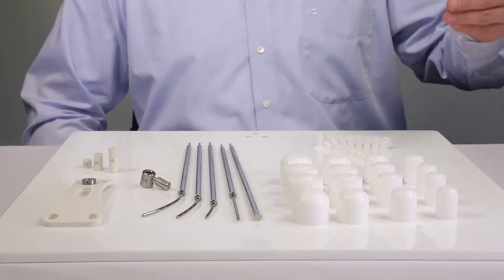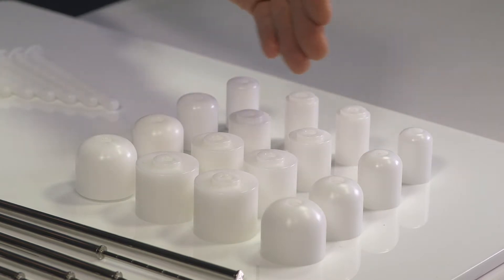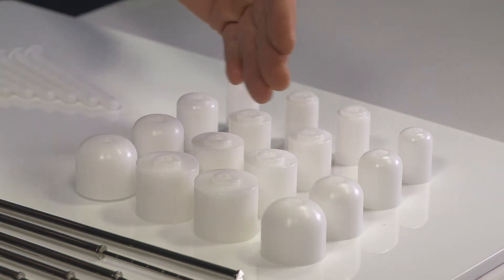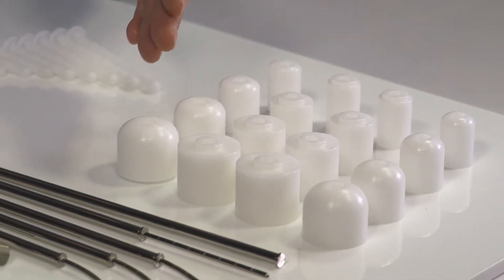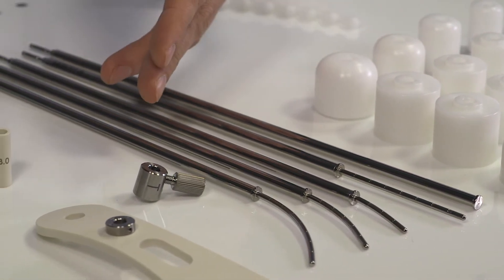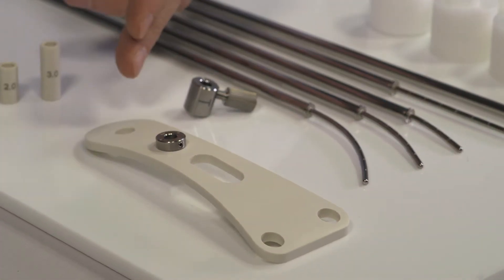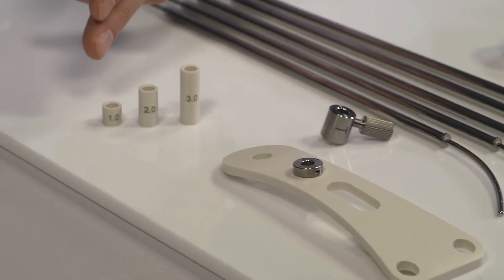The set consists of cylinder segments in four different diameters: 2, 2.5, 3 and 3.5 centimeters, a stump tube, 4 different intra-uterine tubes, a collet lock knob and a collet sleeve, a perineal bar and 3 different spacers.